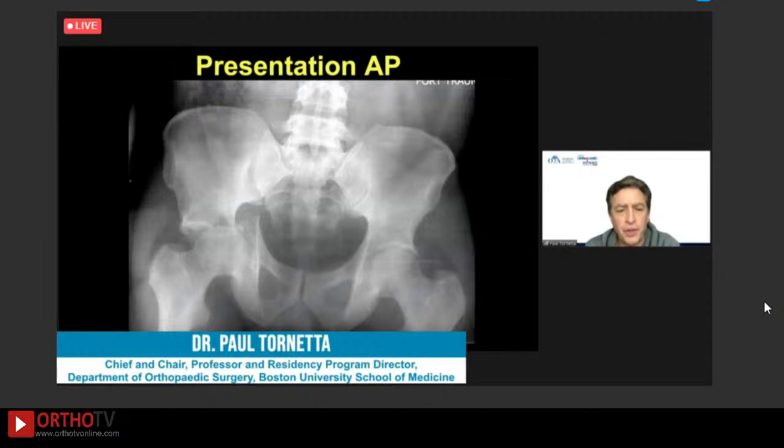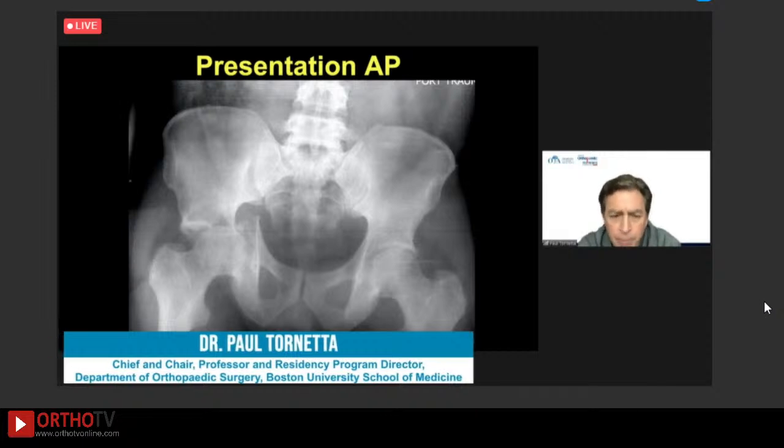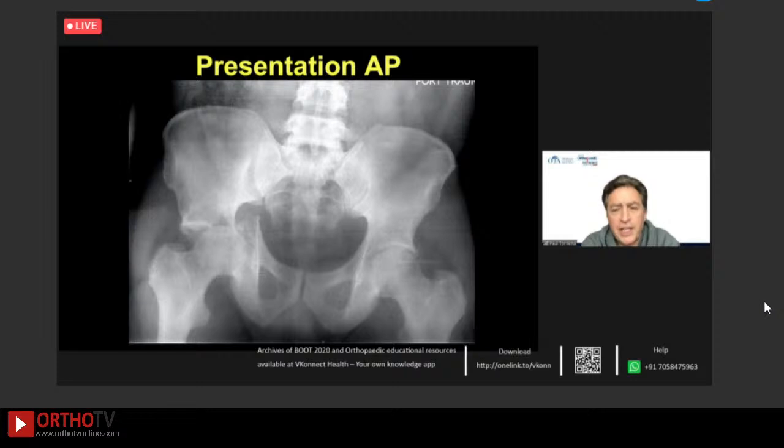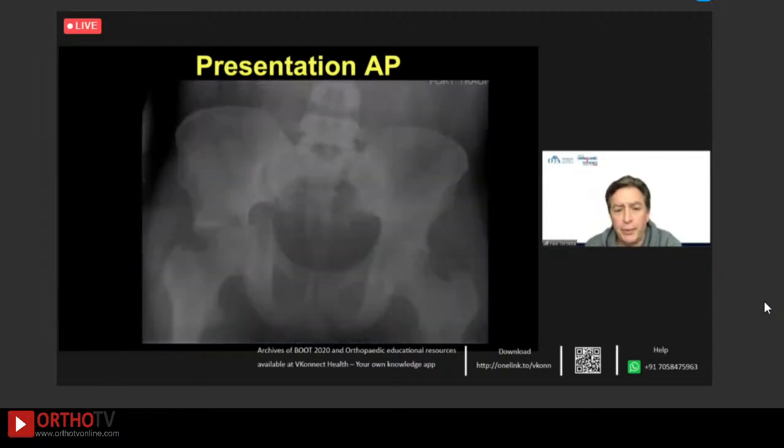And I present this just for the discussion around clamp placement and predictable problems. Not that this is a highly complicated problem. It's a basic transverse pattern, as you see. But when you see the SI joint off, you have to be very careful. I've seen people miss that, because once the hip gets reduced, the SI joint looks better. So here you can see presentation AP.